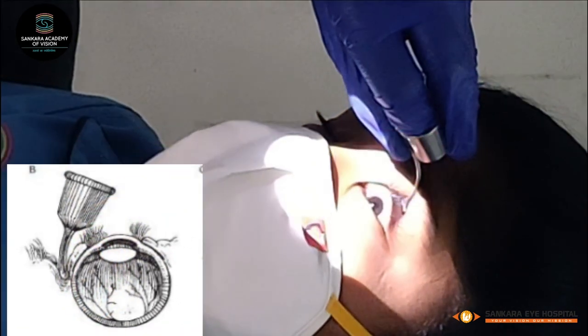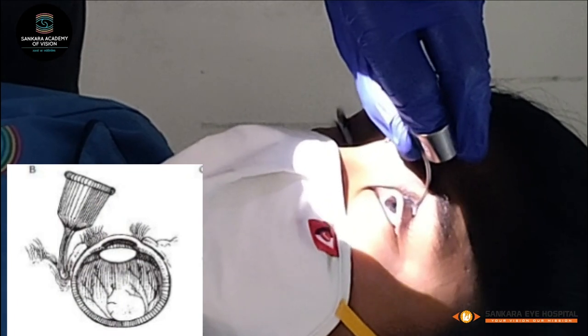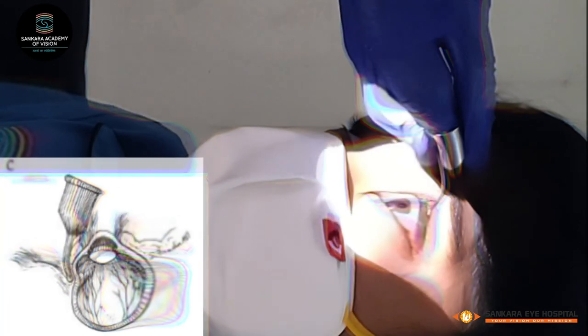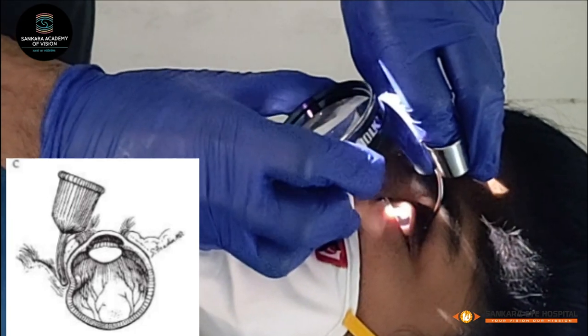Whilst holding it in place, ask the patient to switch their gaze back towards the indenter. Once in place, you need to apply very gentle pressure on the sclera to indent it sufficiently to view the anterior retina up to the ora serrata.